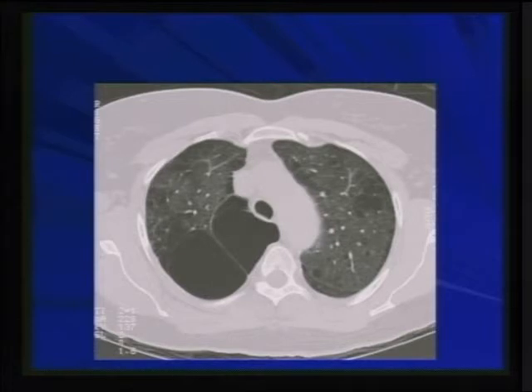But is this on the CAT scan, again, showing different degrees of pulmonary emphysema, these areas of destruction within the confine of the secondary pulmonary lobule here with no definable wall. But it's not until they coalesce together to form this bullous disease that we can see this septation. But here there is no tissue here. This is totally devoid of any lung tissue.